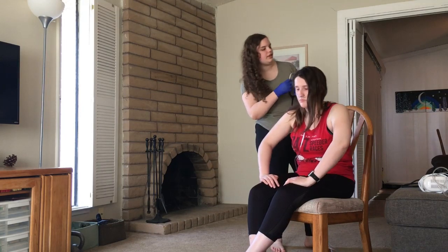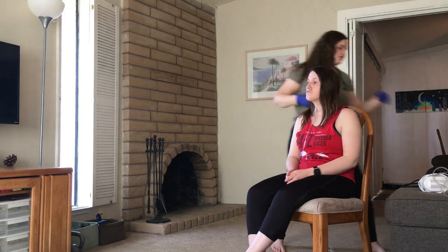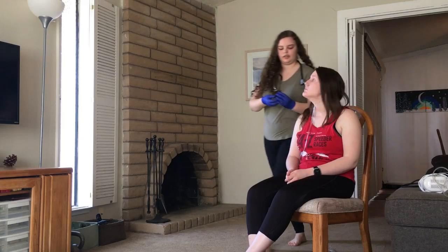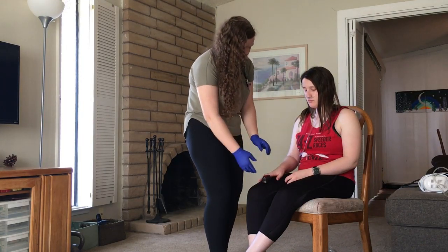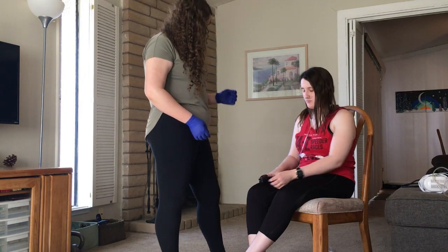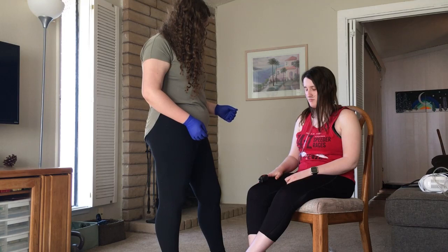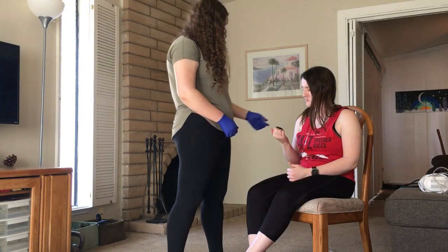Alright, sounding a lot better than before. Less wheezes. We'll check your oxygen saturation real quick. Nice, that's looking good. Much more normal.